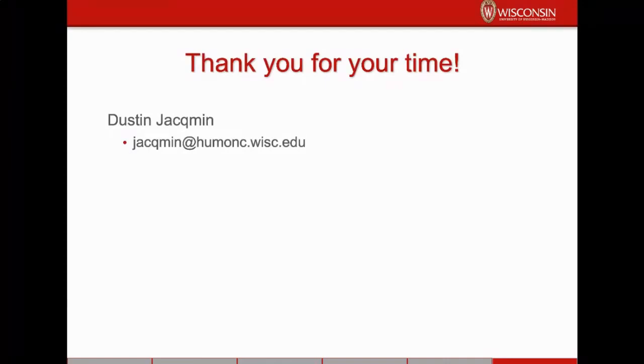Okay, great. Thank you. Our next question here is, what is the difference between local and global for these evaluation criteria? Well, that's a really good question. So local and global refers to how the dose comparisons are done during the gamma analysis. We have this percentage, right? 3% or 2%. And the question is 3% of what? 2% of what? And so when you do a global dose difference analysis, the percent, you're comparing your measurement to the global maximum dose.